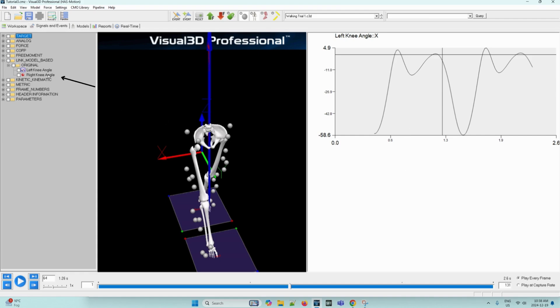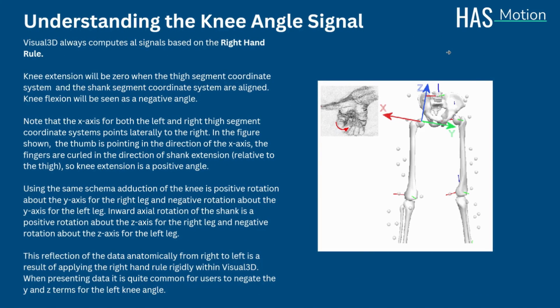This will add the X component of the left knee angle signal to this area in the signals and events processing tab. Then we can go ahead and do the same for the right knee angle. So we right click. Select Graph X. And New Graph. In this segment coordinate system, the Z direction is upwards and the Y represents the anterior. Rotation about the X axis represents flexion and extension. Visual 3D always computes all signals based on the right hand rule.